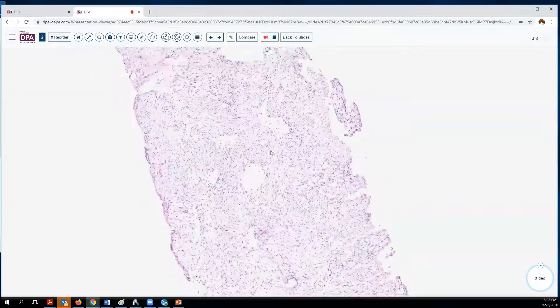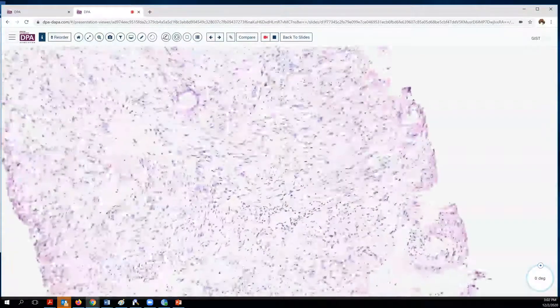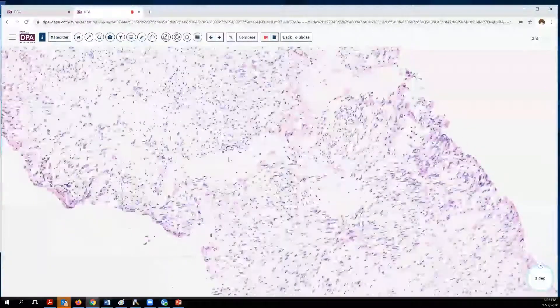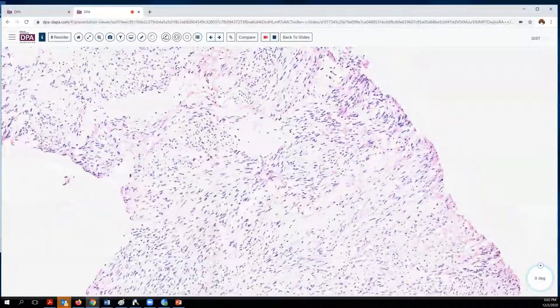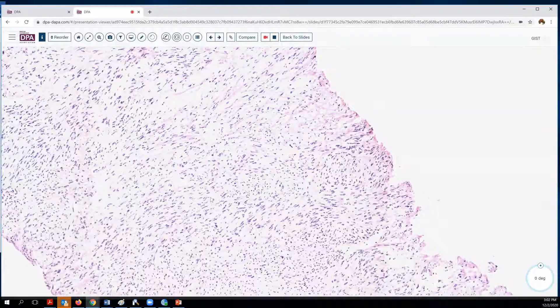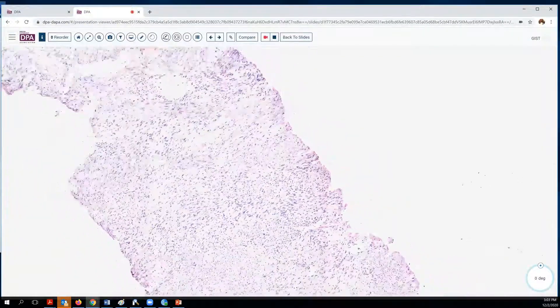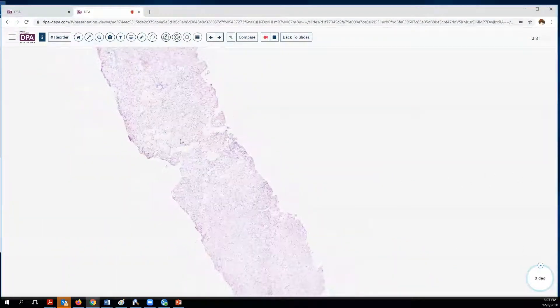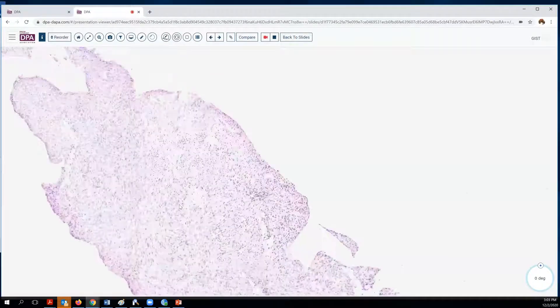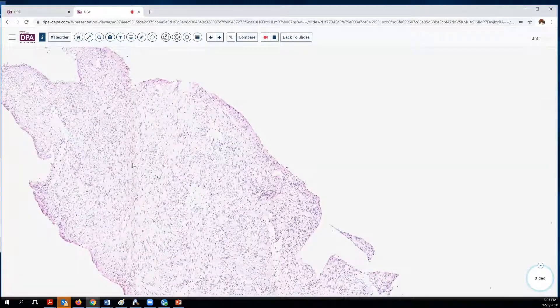We can see that this is a moderately cellular spindle cell lesion. We don't see a high degree of pleomorphism. Not a lot of pink cytoplasm, but there is some streaming and coursing of tumor cells. No wavy changes per se, and no necrosis seen on the biopsy. With that impression, we reported that we had an adequate sample and a low-grade, or at least cytologically low-grade, spindle cell neoplasm that would need further evaluation.